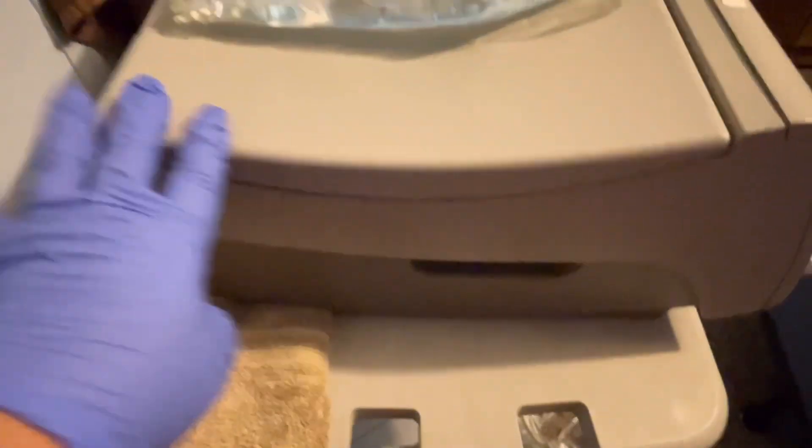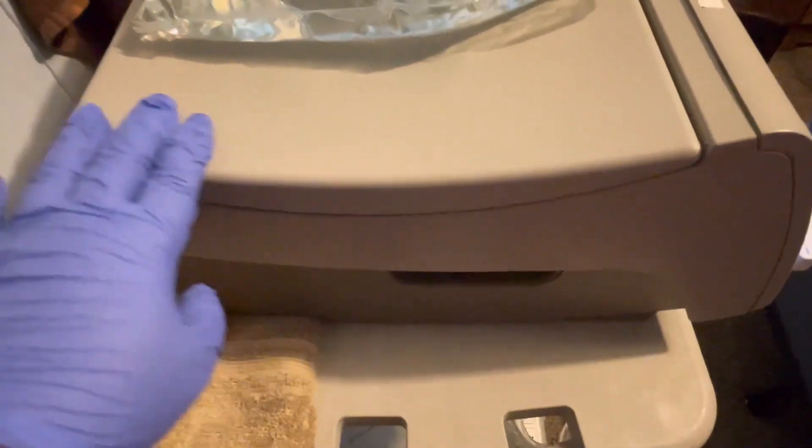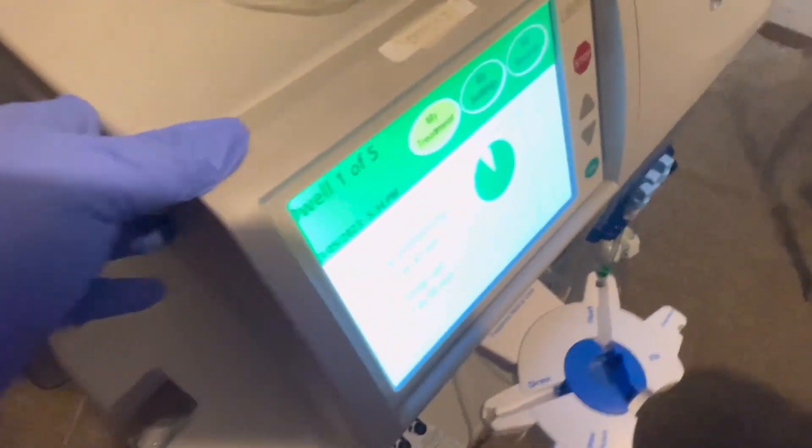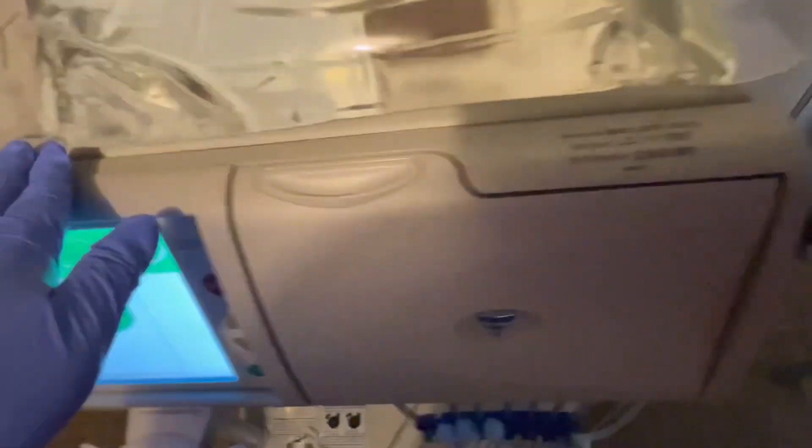This is actually a very small machine. When you think about dialysis you might think it's a huge setup, but it's not. I'm just putting a towel over it because of the vibration — once it's draining it vibrates a little bit and it's really noisy.